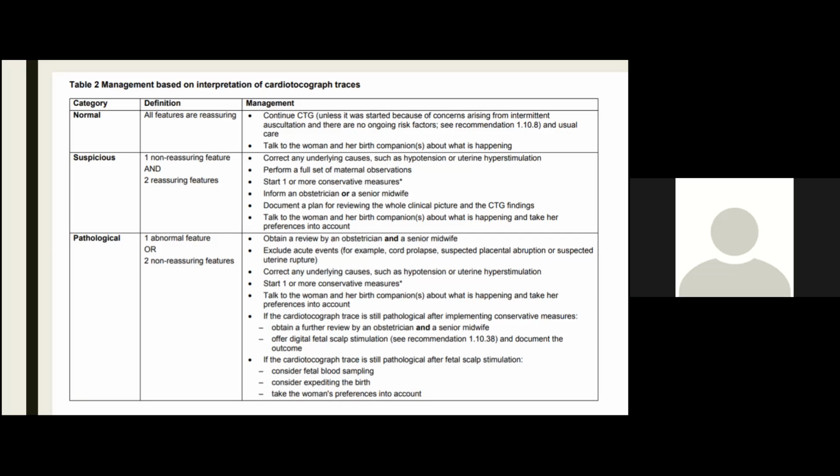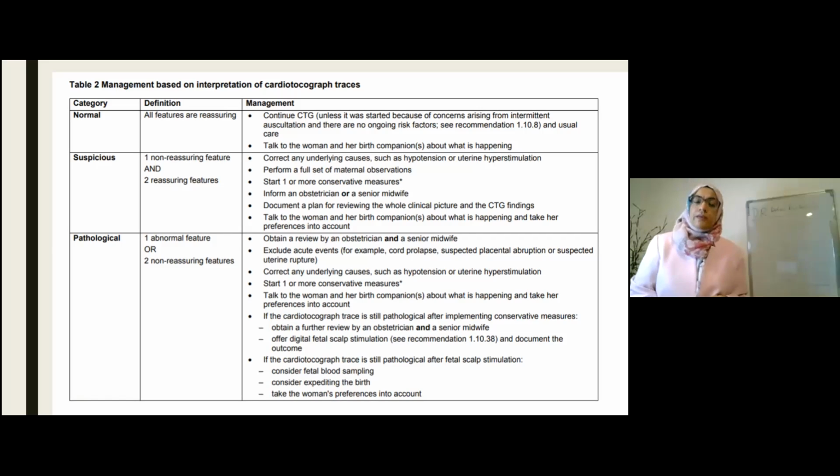Yeah, there's another question someone's asked. Can a CTG be done anytime during the pregnancy? Yes, there are two types: when a woman is in labor and when she is not in labor. When she is not in labor, just to reassure the woman, sometimes we do a CTG. If we are concerned that the size of the baby is small or she's not feeling the movements of the baby, that is when the CTGs are really reassuring. And we tell the woman that, look, we've done a CTG, it's got accelerations, no decelerations, good variability, and the baby is fine. So that's when we will do it before labor.